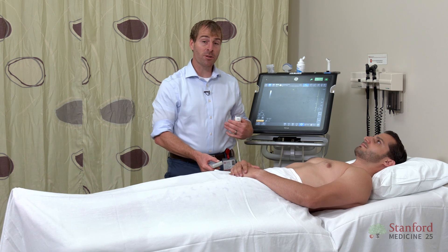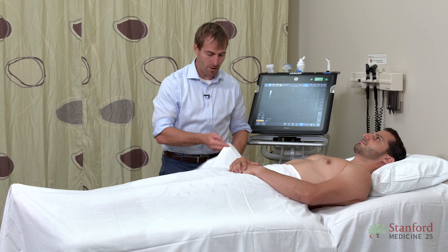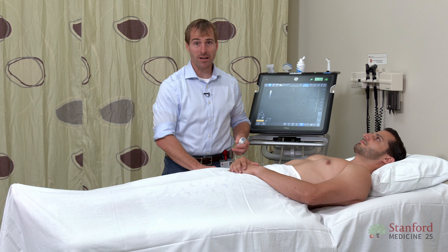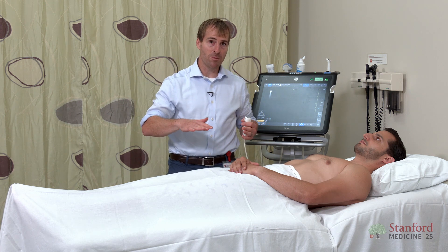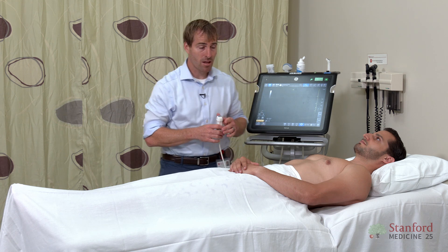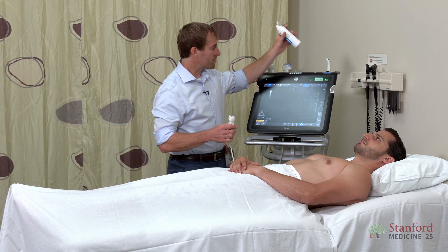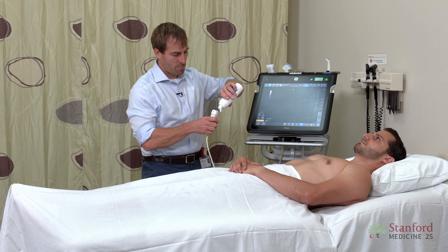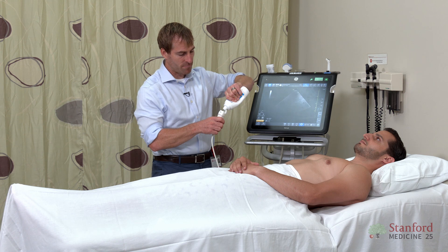The next thing I would normally do is darken the room. Now, because we're shooting a video, we're going to keep it bright in here, but it really does help to get the room a little bit darker — it's going to help you see the ultrasound screen better. Next, I'm going to put some gel on my probe and position my patient.